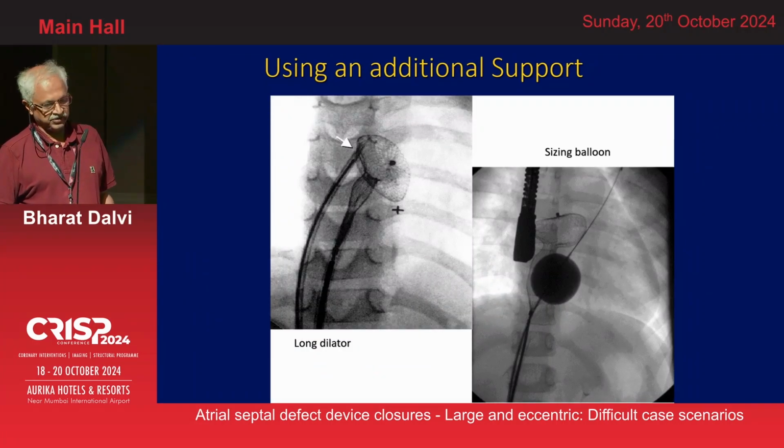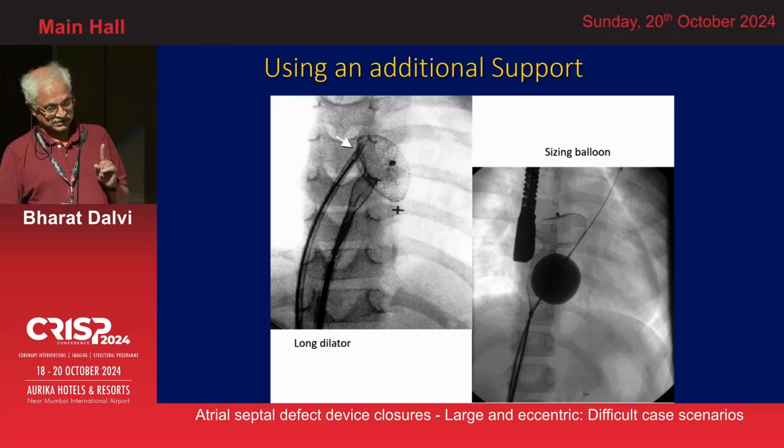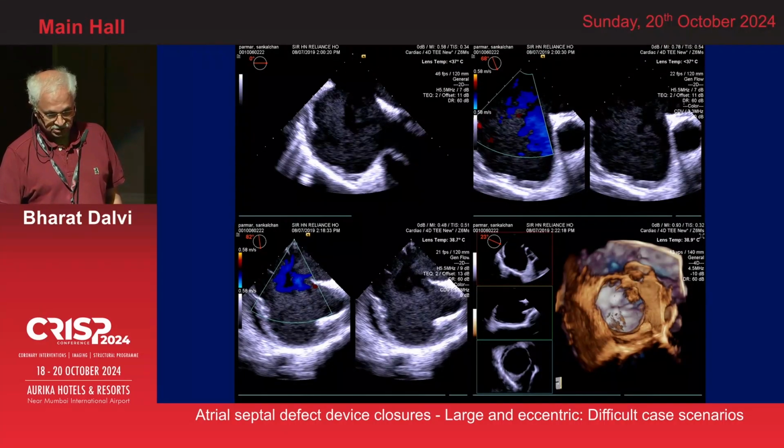And as you know, we have been very fond of using this additional support, and we described this technique in 2004. And I'm very happy to tell you that 20 years down the line, this technique is still one of the commonest techniques used the world over for taking care of large ASDs in adults or even in children.